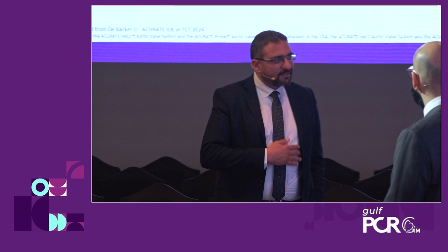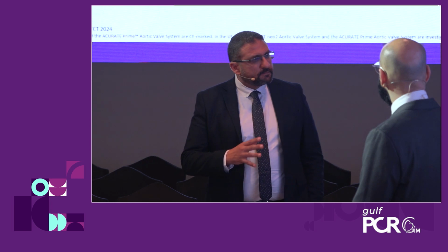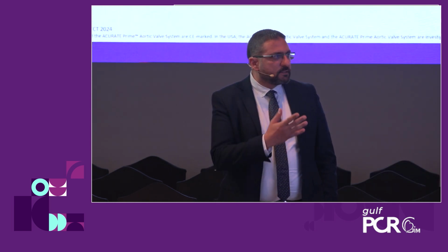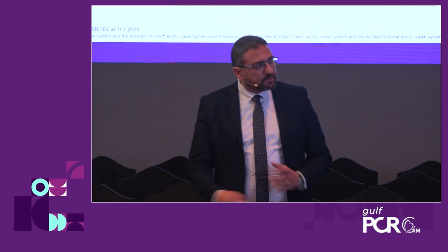I myself do pre-dilate almost 90% of my TAVI patients, whatever the platform I'm using. Pre-dilate always. And post-dilatation, on average, 30% of my cases I do post-dilatation. With ACURATE because I'm using the same balloon. So for the last 6 months, I've been routinely post-dilating as well.